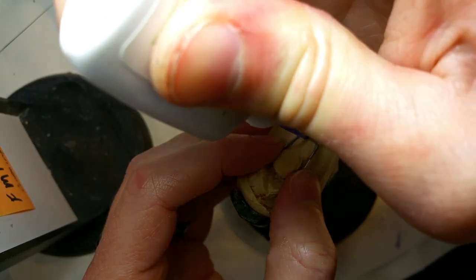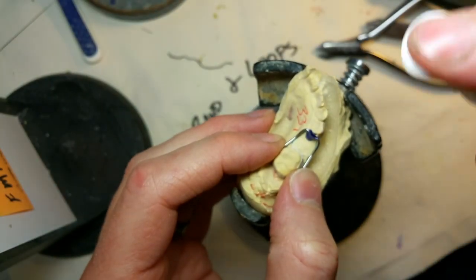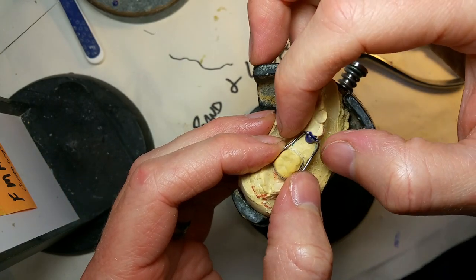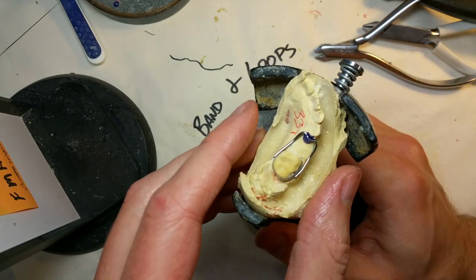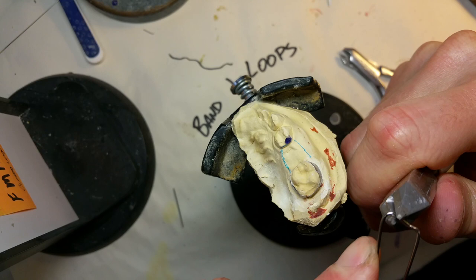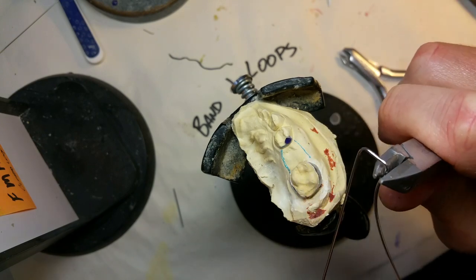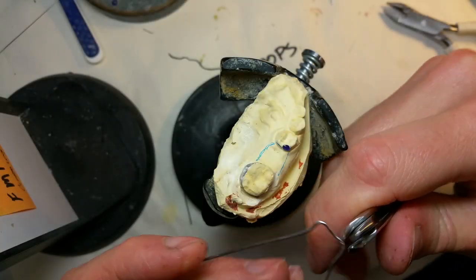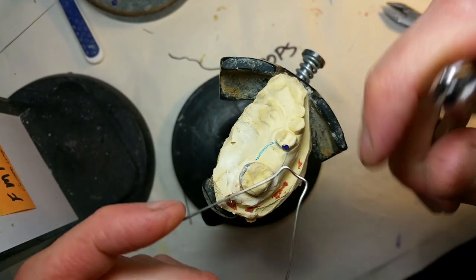You can kind of see the shape of it. I'm using a little Zap-It here — it's got a little spray activator and takes about three seconds to set up. This is something we don't do anymore: we don't Zap-It right against the abutment or adjacent tooth, because we found issues when we separate the tooth. I pull the wires apart where they crossed over each other, then contour the front of it to wrap around the tooth a little more for stability.